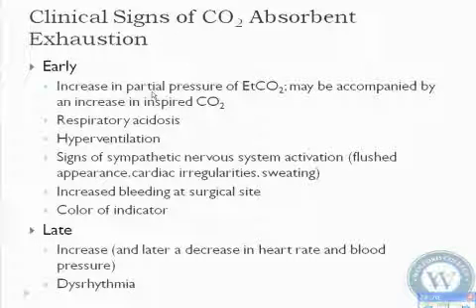All right. So real quick, some of the early clinical signs that you will notice when your CO2 absorber is completely exhausted. You'll start to see a rise in end-tidal CO2, of course. So you're running people at 32. That's a good place. We like people who are under general anesthesia at 32, 33. You start seeing them go to 37, 38, 42, and you have no reason for it. You don't have any idea why.